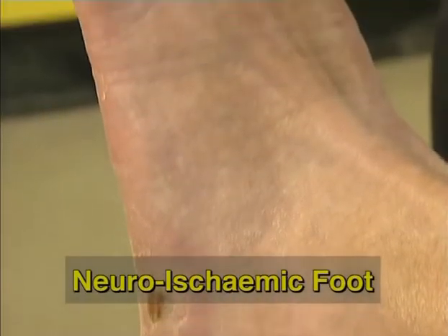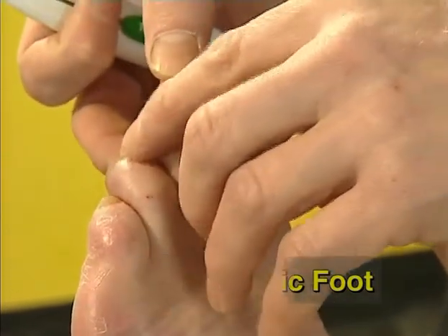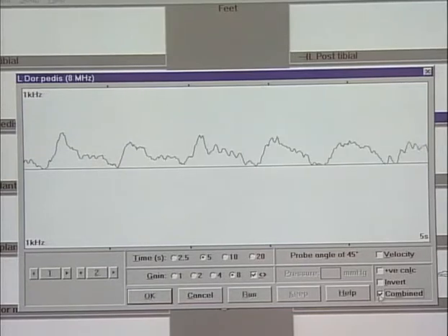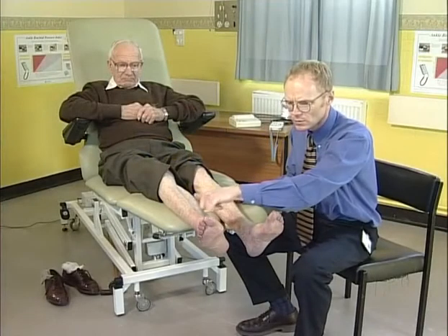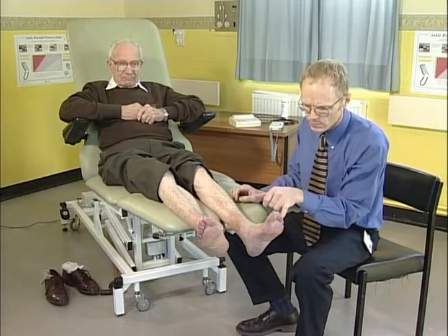The neuroischemic foot is characterized by the presence of neuropathy and ischemia. Frequently there is patchy sensation loss, and the foot pulses are weak and typically monophasic with a low pitch. A complication that you may see is peripheral vascular disease.